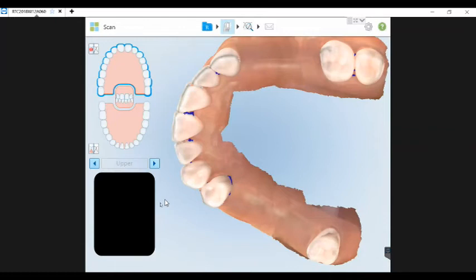I do not have a partial, but that would probably be a really good topic to include in another presentation. I am making a note to myself, and I'm saying it out loud so Brittany and Jessica can hold me to this. As part of our follow-up, I actually have an NDX document with 3 different recommended ways to scan for a crown under an existing partial. And I believe that's what you just asked. I just don't happen to have a partial to do the scanning.